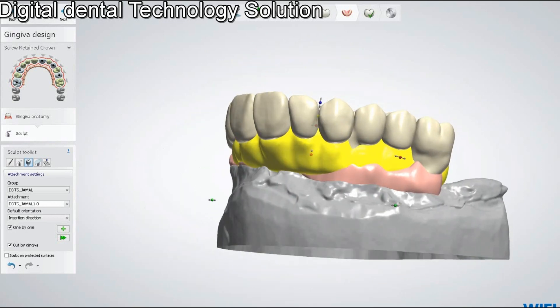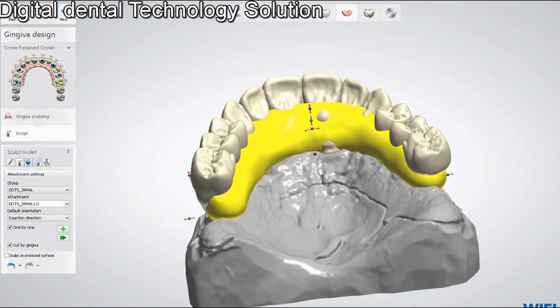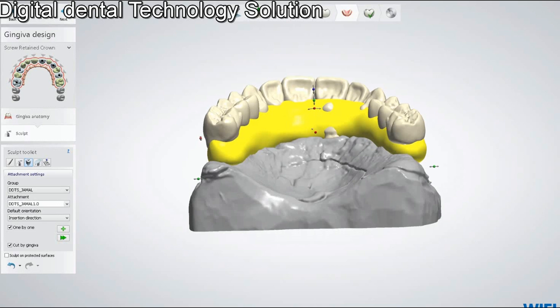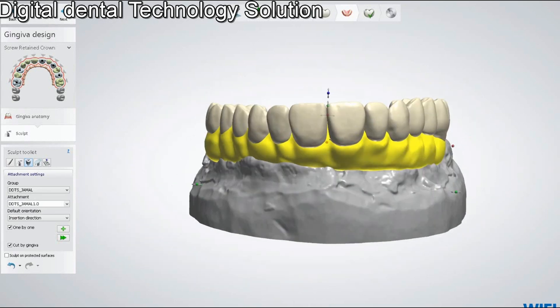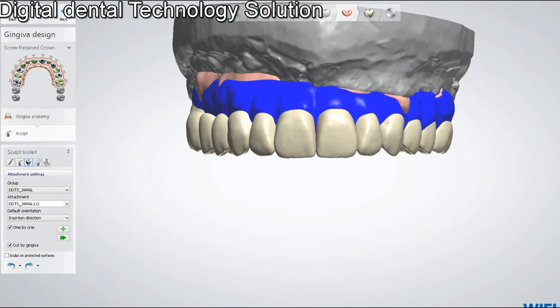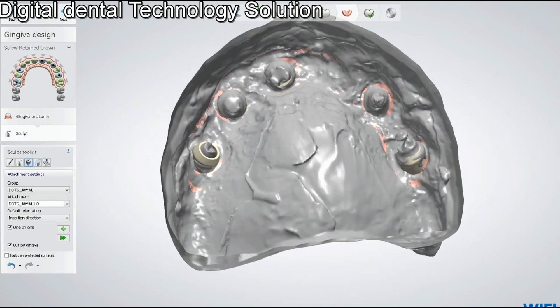According to your setup, you can scale it. After adjusting, I have to just apply it — this is the apply button. I apply the attachment and ignore this message. And here we go — now you can see we have a gingival attachment, and it's cut with the gingival.